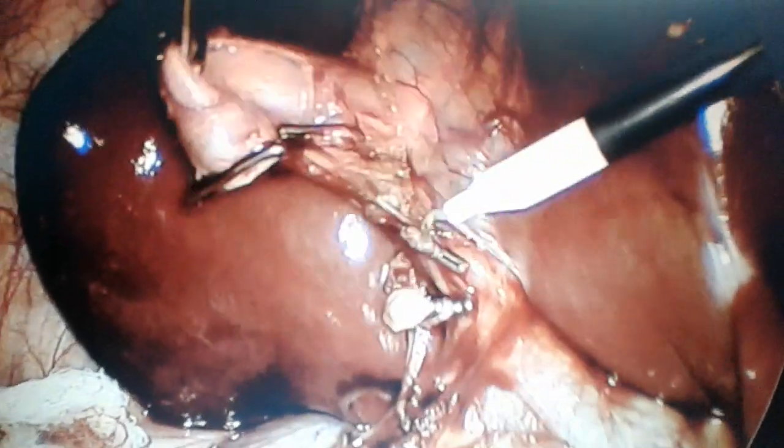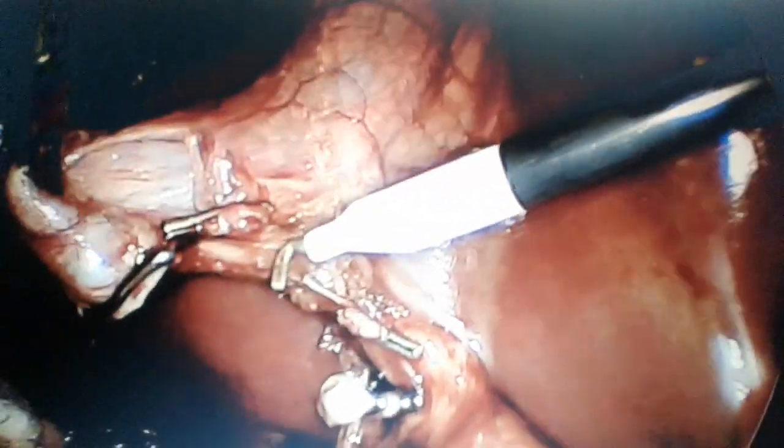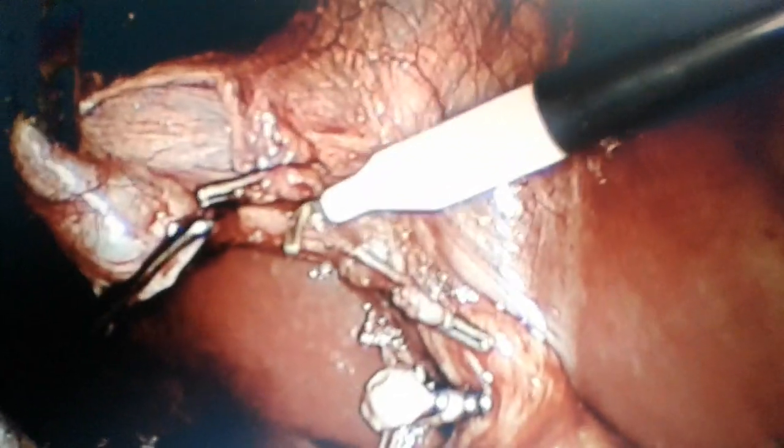Now this instrument is electro hook. You can see the tip of this instrument just like a hook, and there are basically two active parts with the help of which we can dissect the tissues. One is the tip of this electro hook and another one is the shoulder.